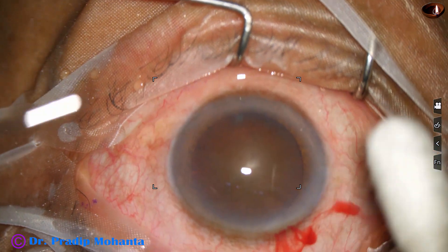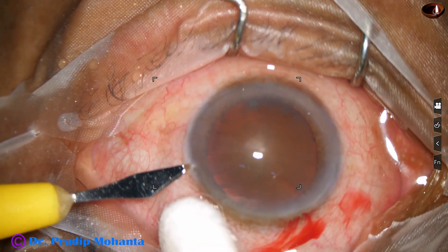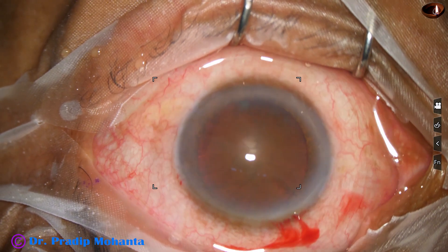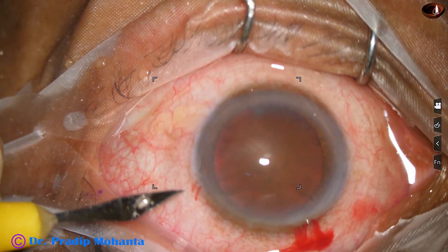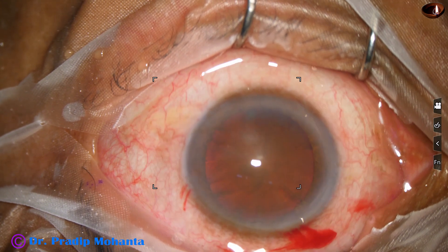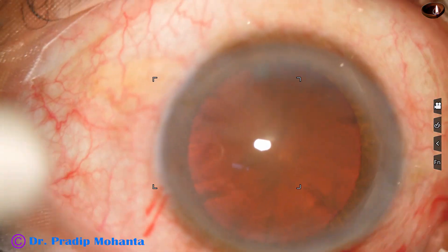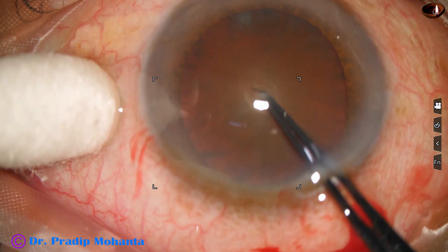And now I am making a side port about 3 o'clock hours away from the main incision. In this case it is appearing more than 3 o'clock hours. And now capsulorhexis is to be done. I take utrata forceps. The microscope has step magnification — it is OMS 90 from Topcon.